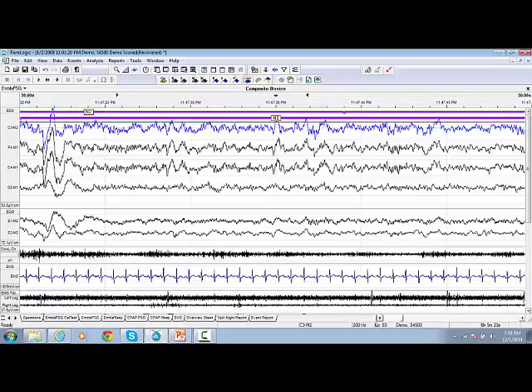A scoring session must be present in the workpad for the hypnogram to display. If there are more than one scoring session in the workpad, you are prompted to select the session on which the hypnogram will be based.